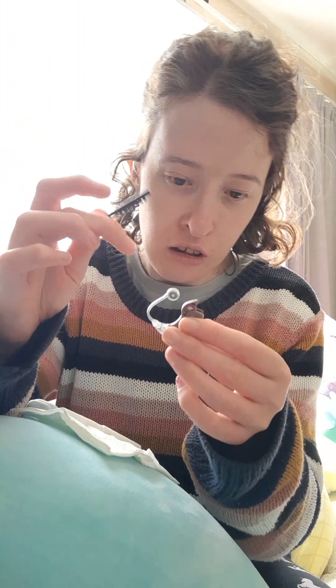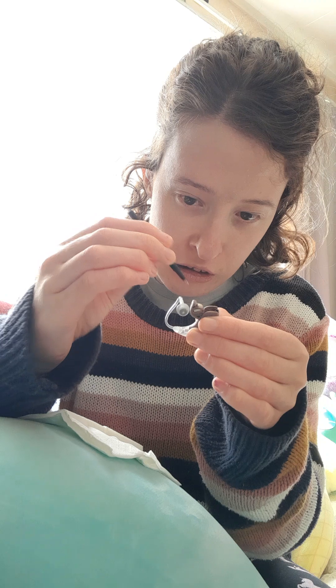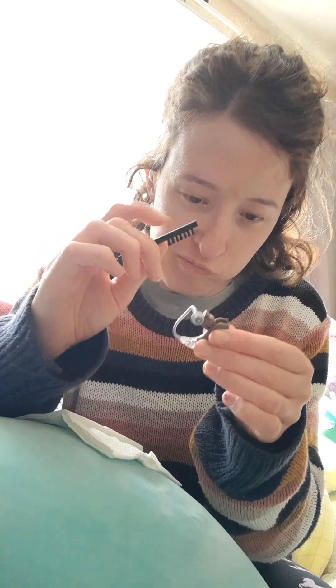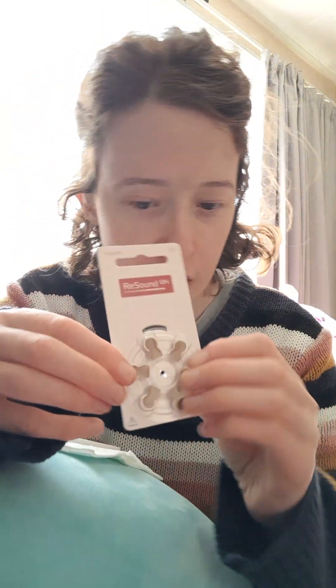So this is how I change my little thing. Where is it? Where is it? Oh no. I'm still learning, guys. These are the little batteries that I take — they are very small and difficult.